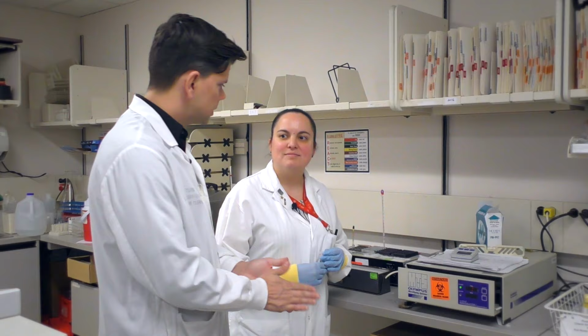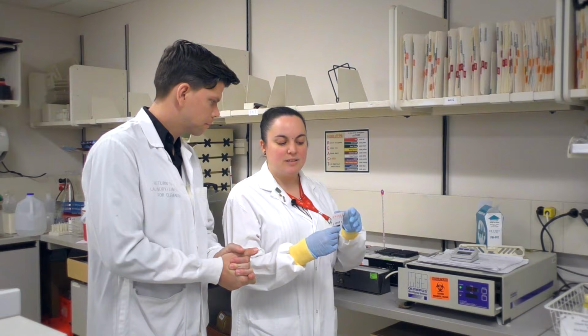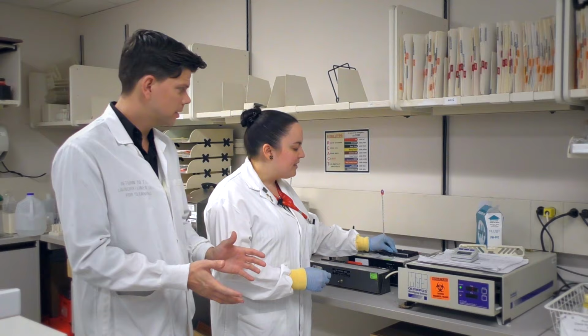So what we would do after we've added all of our reagents and our patient sample into our gel card, we actually put it here into our incubator. Does that mean you heat it up? Yes, it heats at 37 degrees Celsius, and it's going to do that for 20 minutes. Why do you have to heat it up? You want to bring it up to basically body temperature, or pretty close to body temperature, so that it actually is mimicking what the reaction is going to be inside the patient's body with that donor unit.